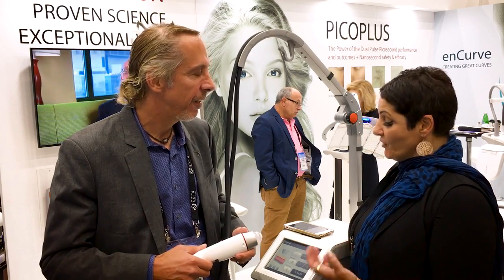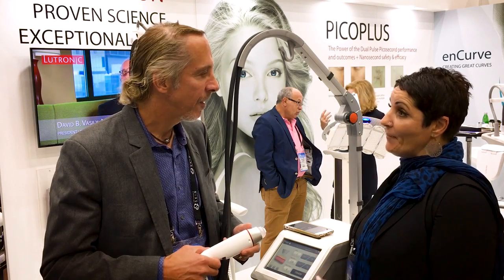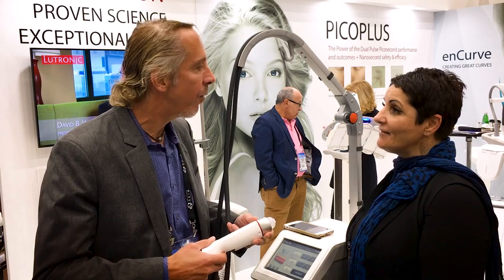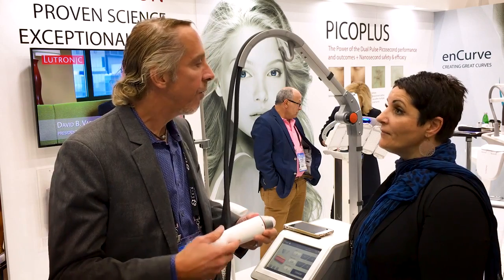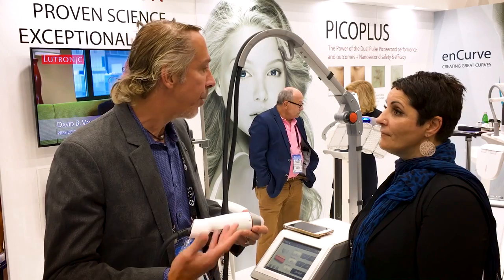I just want to ask you about the Infini laser. Could you tell us a bit about it? Okay, it's actually not a laser, but it's a radio frequency, which is energy. What it's used for is skin tightening, for laxity, for wrinkles, and particularly good for scars, particularly acne scars.